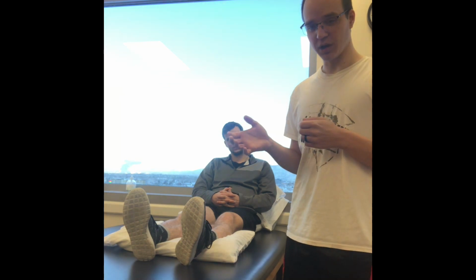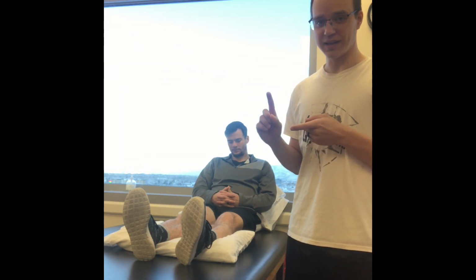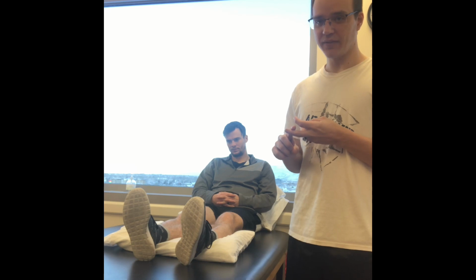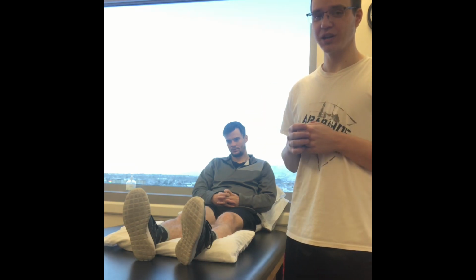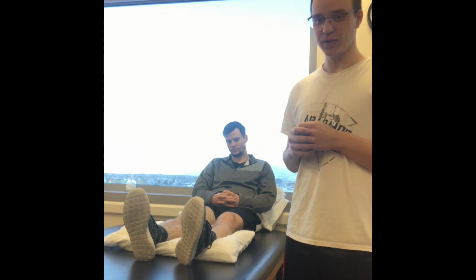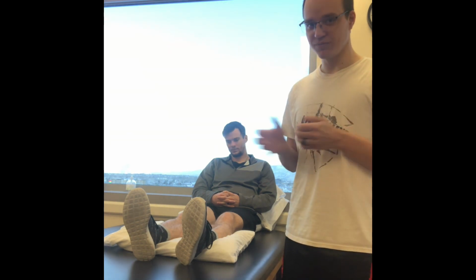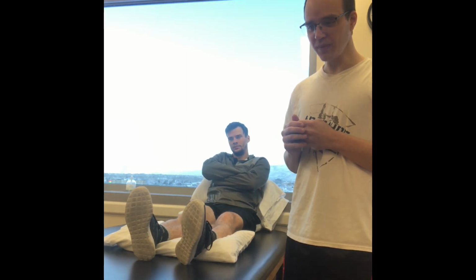So there are some contraindications as well, why you wouldn't want to use this. If the patient has any active DVTs, deep vein thromboses, or active cancers, if they have impaired mentation, so they can't really understand what you're doing or communicate with you as to what they're feeling, you would want to avoid this. Also, if they have an implanted device like a pacemaker up here, again, just avoid that just to be safe and protect the patient.